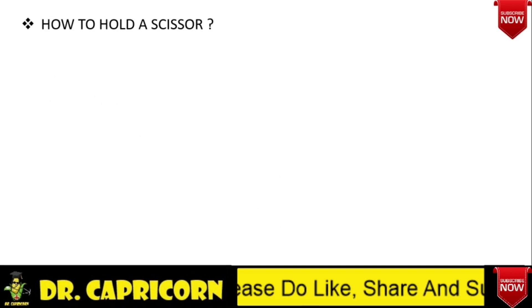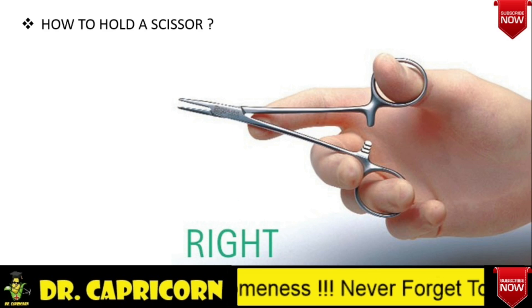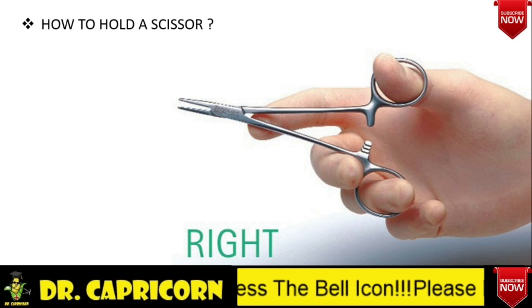Lastly, let's learn how to hold a scissor correctly. Whenever you get a scissor in examinations, the examiner always asks you to demonstrate how you hold a scissor. The scissor is held by keeping the thumb and ring finger in the two finger rings. As shown in this picture, a common mistake done by students is that they put the middle finger instead of the ring finger. So keep that in mind — we have to keep the thumb and ring finger in the finger rings, and it should be guided by the index finger. That's the right way of holding a scissor or any artery forceps.